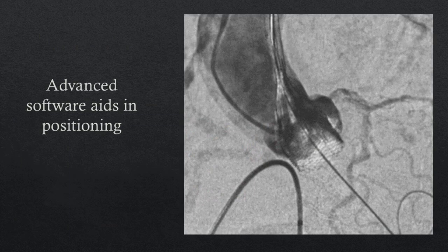Advancements in software have greatly improved TAVR success by decreasing instances of malposition and post-procedural complications. Some of the most common complications that plague TAVR devices include malpositioning, crimp-induced leaflet damage, paravalvular leaks, thrombosis, conduction abnormalities, and prosthesis patient mismatch, or PPM. These complications are currently difficult to predict prior to the procedure. There are patient-specific risk factors that are thought to include the calcification landscape of the native valve, properties of the aortic root, and conditions such as hypertension, coronary artery disease, heart failure, and bleeding.